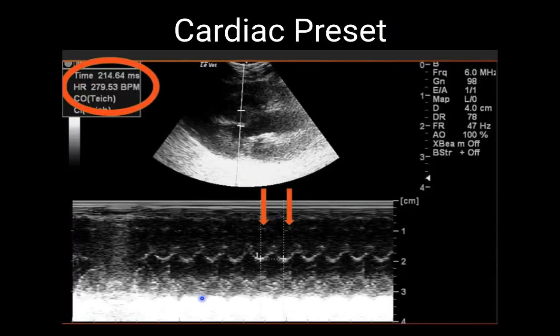The last step in getting the heart rate using the cardiac preset is to choose one cardiac cycle. To do that, put your caliper at one systole and extend it to the following systole — just one cardiac cycle. You can use two systoles or two diastoles; it doesn't matter, as long as it spans one full cardiac cycle. As soon as you confirm the caliper position, the machine gives you the fetal heart rate — in this case, 279 beats per minute, which would be extremely hard to obtain by subjective counting.